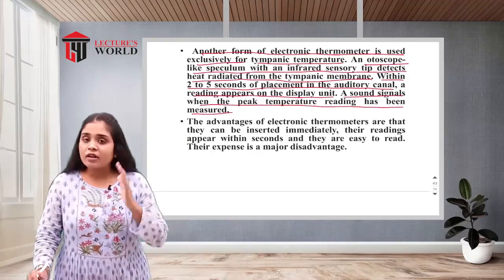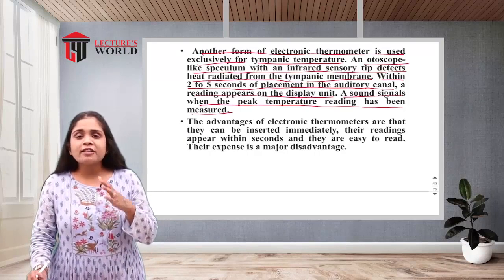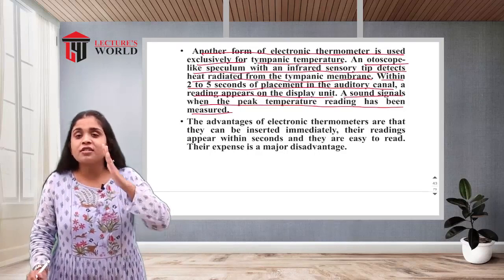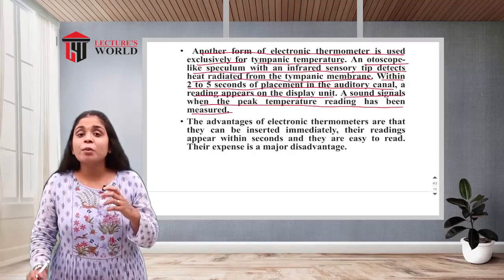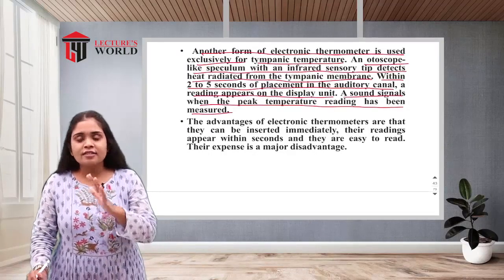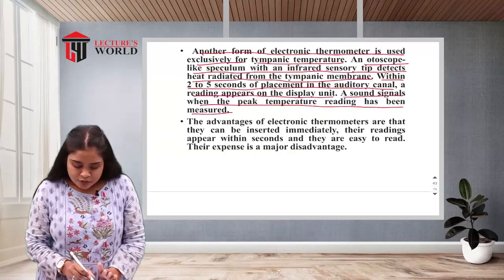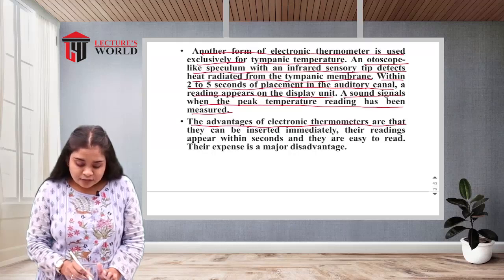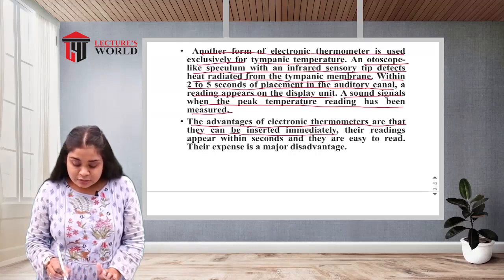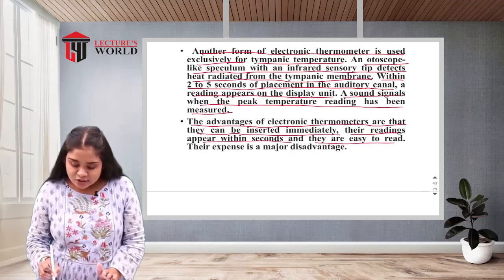Here also they will have a beeping sound. When the thermometer reaches the highest temperature of the body of the patient, that time it will start to beep. So you have to understand that the temperature has been recorded. The advantages of the electronic thermometer are that they can be inserted immediately, the readings appear within seconds, and they are easy to read.